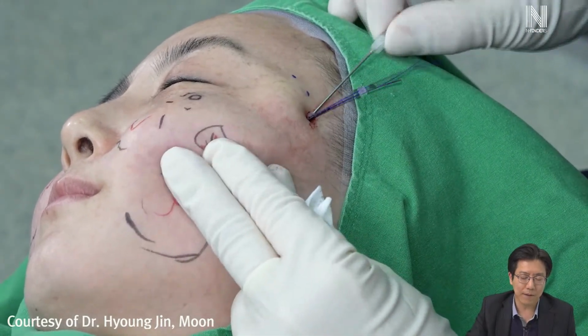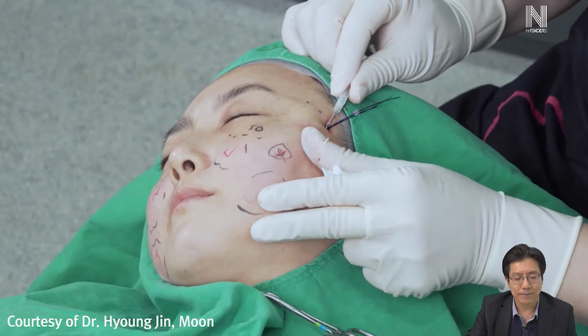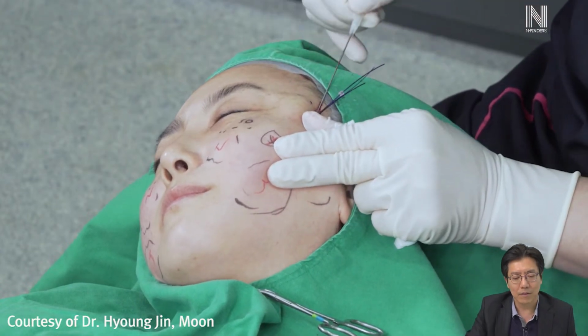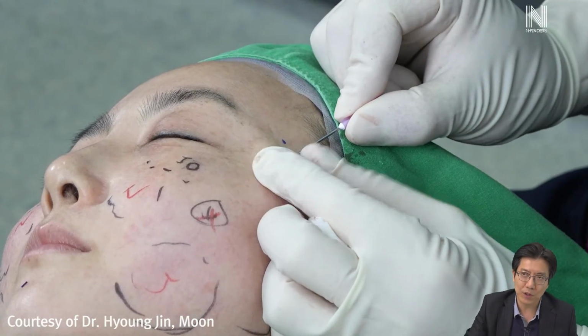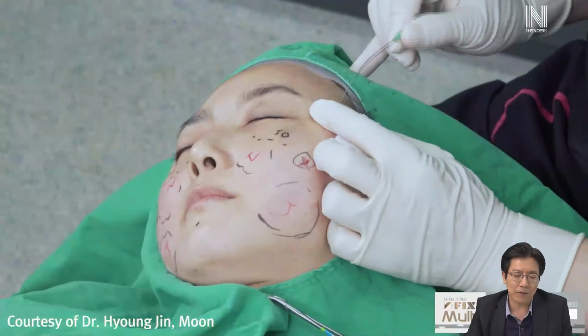You should always think about vector and plane, and also the entry point and target fat. So very simple. If you know the target, the vector, and the safe anatomical plane, everything's okay.